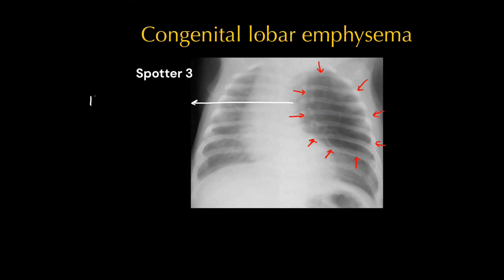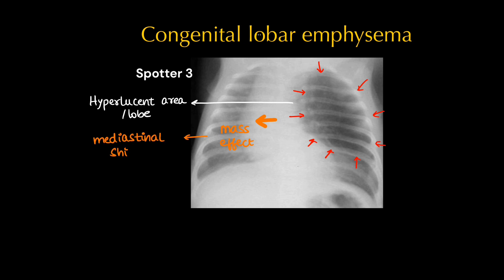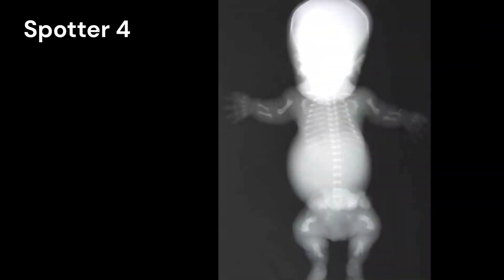Spotter 3 was congenital lobar emphysema. Here we can see lucent lung parenchyma in the left upper zone with mass effect, i.e. mediastinal shift towards the opposite side. The most common site is the left upper lobe.